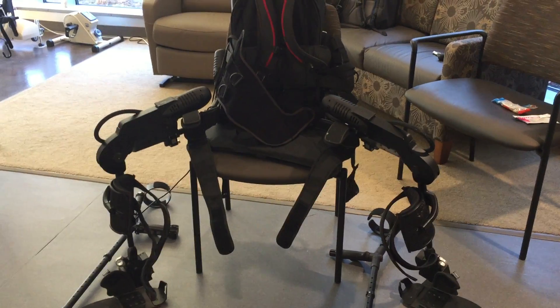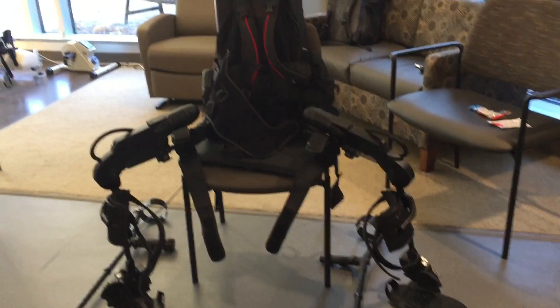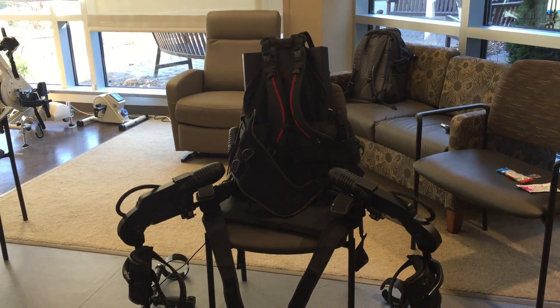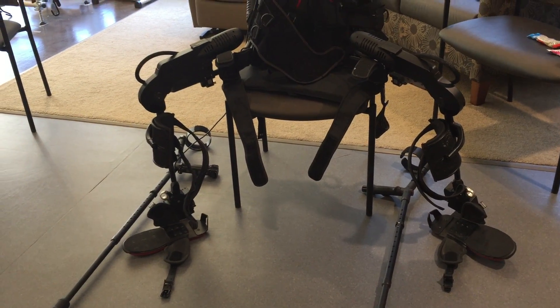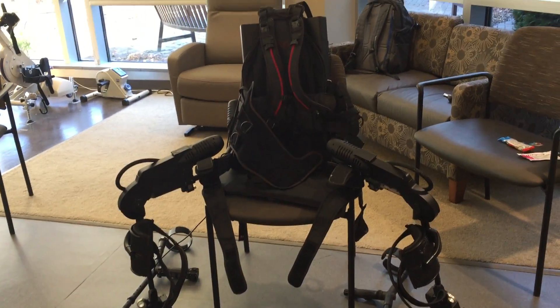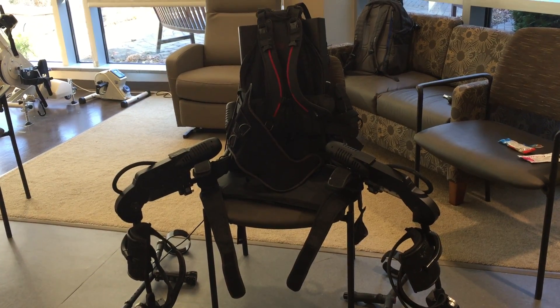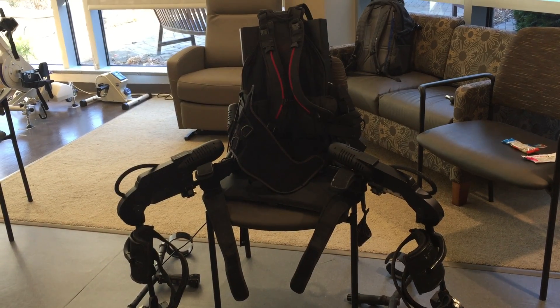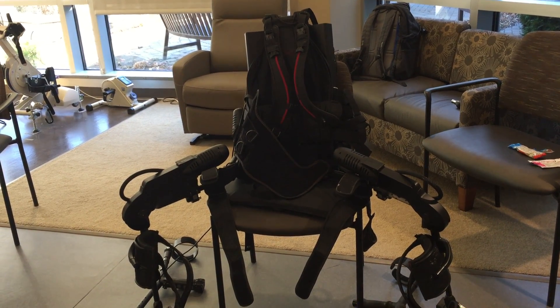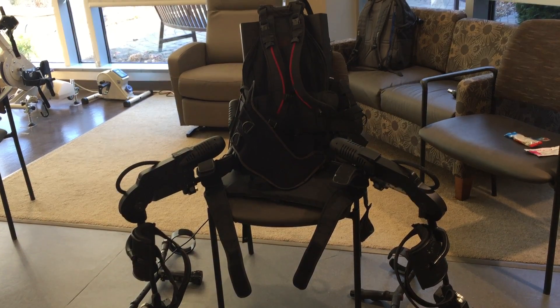This is a robotic exoskeleton used for gait training and rehabilitation. It allows patients who have had a spinal cord injury or stroke to get upright sooner, take higher dosages of steps, and maximize gait training in an efficient manner.